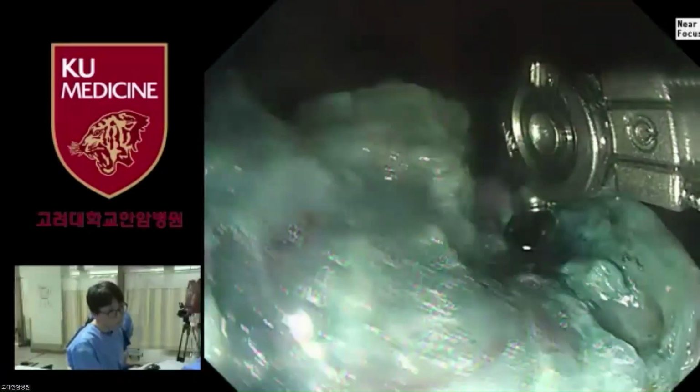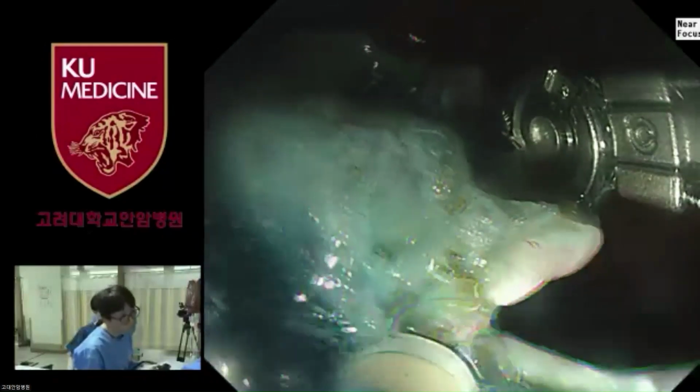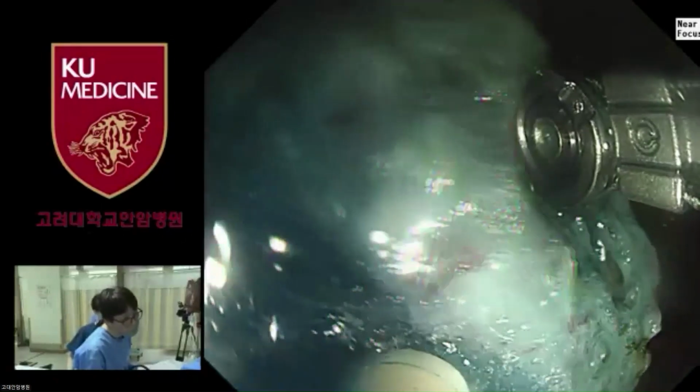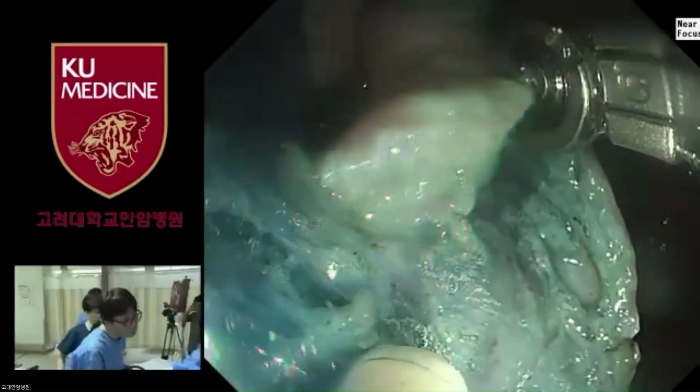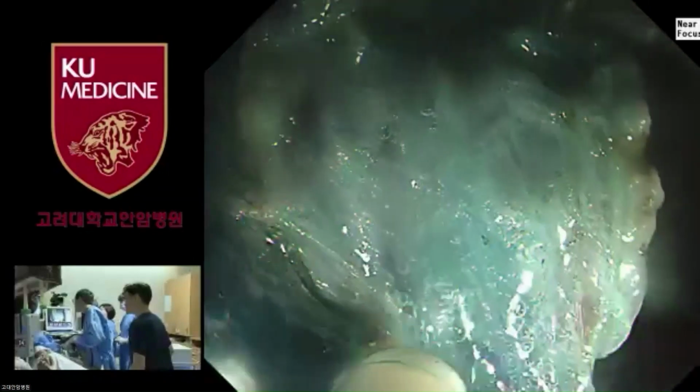Okay, that's not that difficult, because we just follow our pace to dissect, and as you can see, we can finish this kind of dissection quite faster. Sorry for pushing you, but please enjoy the several minutes. We want to make it just on time, so we dissect a little bit slower. Professor Jeon is really excellent, doing the procedure right now.